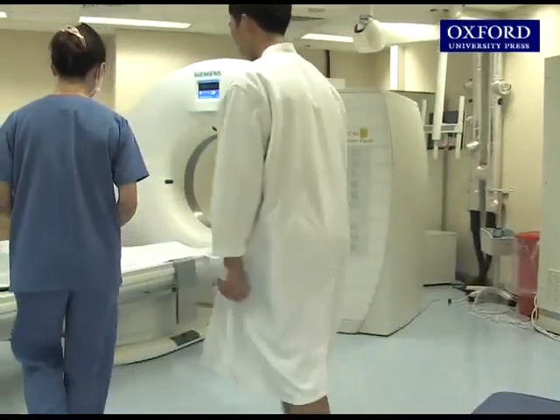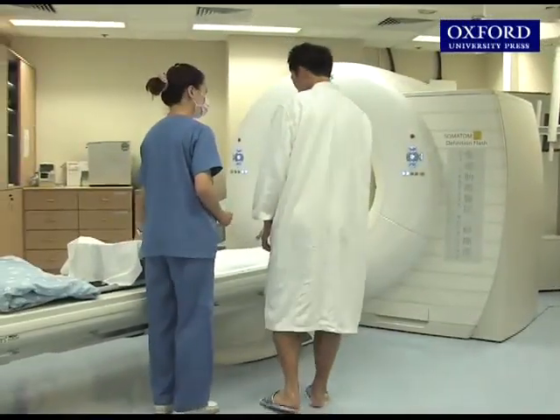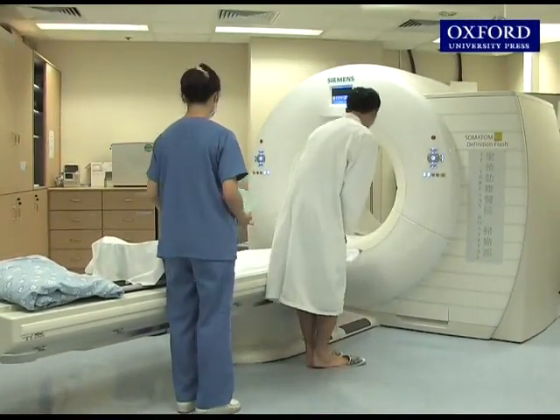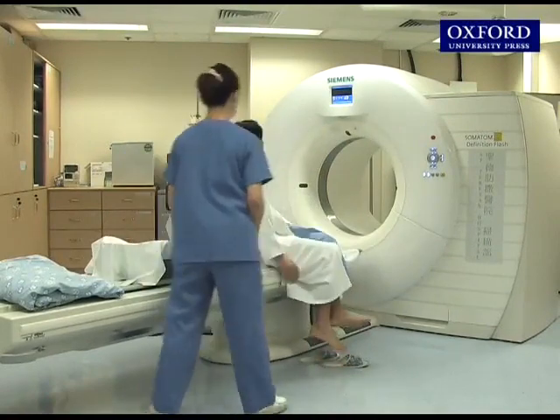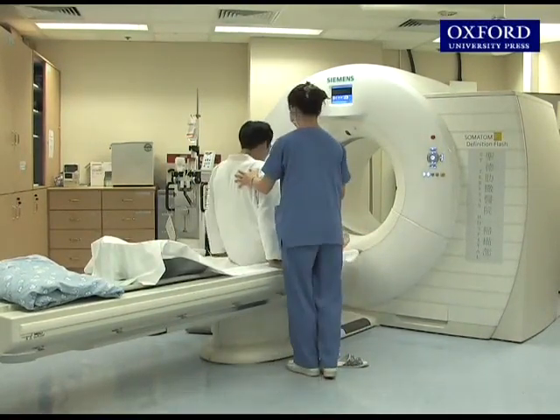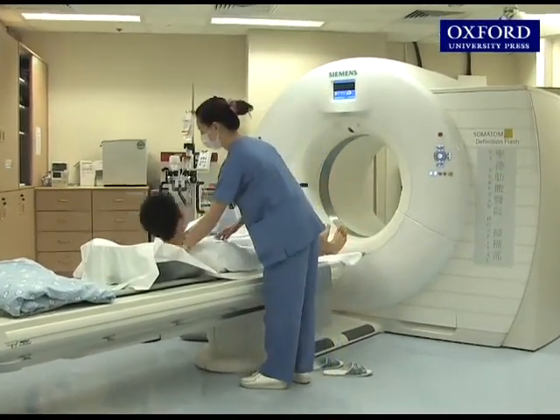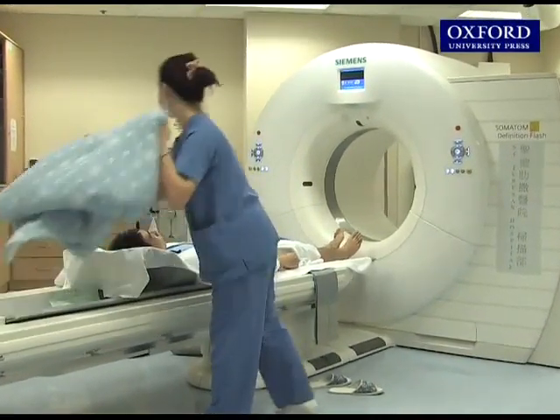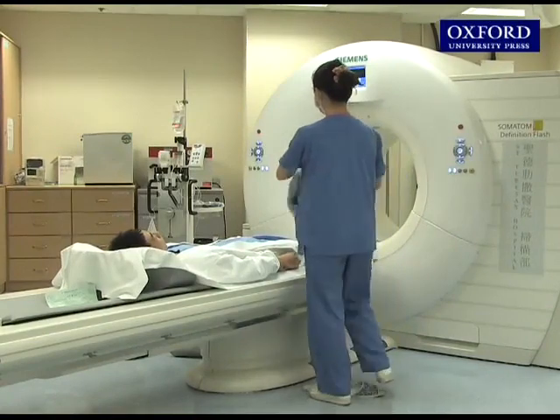This is a CT scanner. Inside the machine there is an X-ray source on one side and a row of detectors on the other side. Before the scan, the nurse will position the patient on the examination bed.